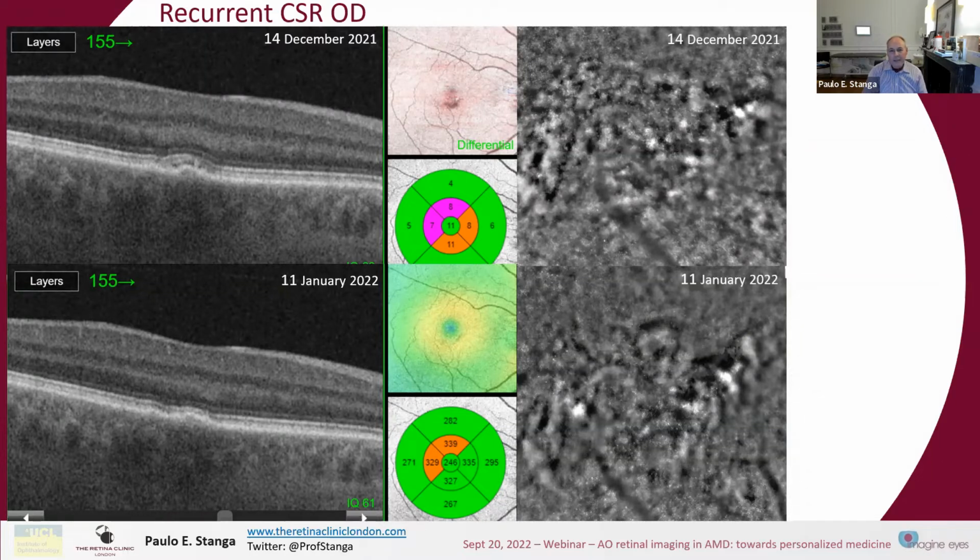I would like to point your attention to a very recent publication from Bousquet, published in Retina this year, that showed, in patients with unilateral CSR, the presence in the fellow eye of reduced density of foveal cones in the absence of decreased visual acuity and even photoreceptor line disruption on OCT scans.